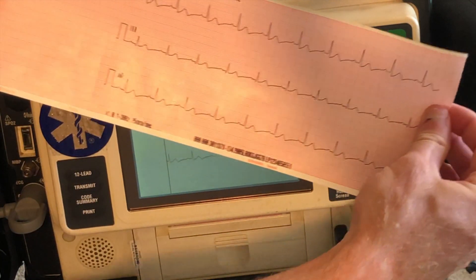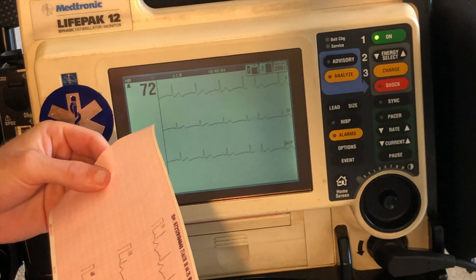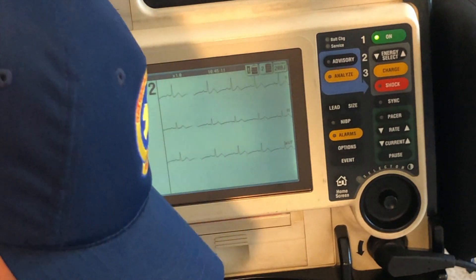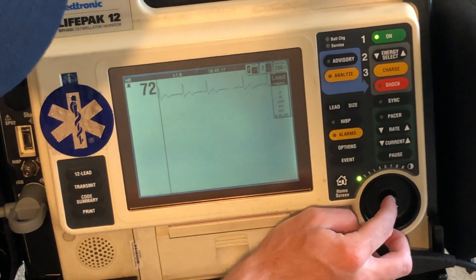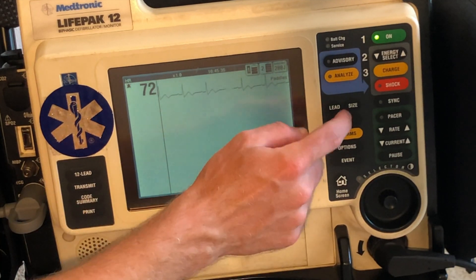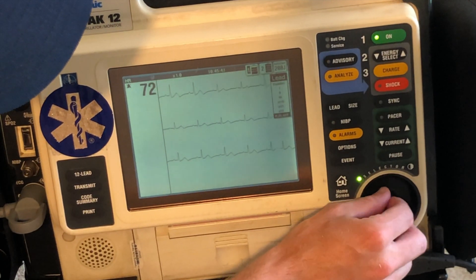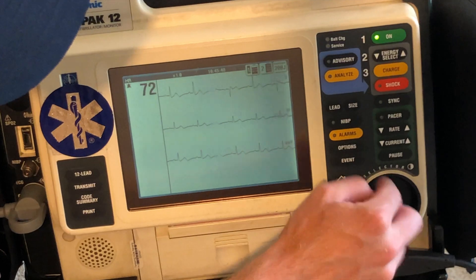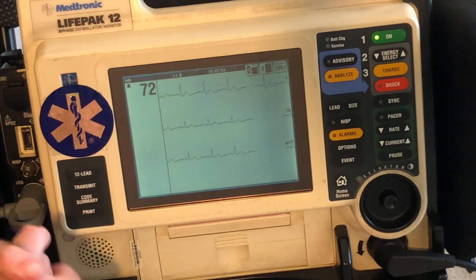Now here's our EKG. I'm looking at my strip, and you're always going to look at lead two. Now if you want to change the leads on here, you hit lead. See right now I'm looking at the paddles — I actually have a simulator hooked up showing you this rhythm, this 72. I can change on the screen the leads I'm looking at. So I can go here to two, three, and AVF again — I can change which leads I'm looking at by scrolling through. All you do is hit lead and select the lead you want. I usually keep it at two, three, and AVF.